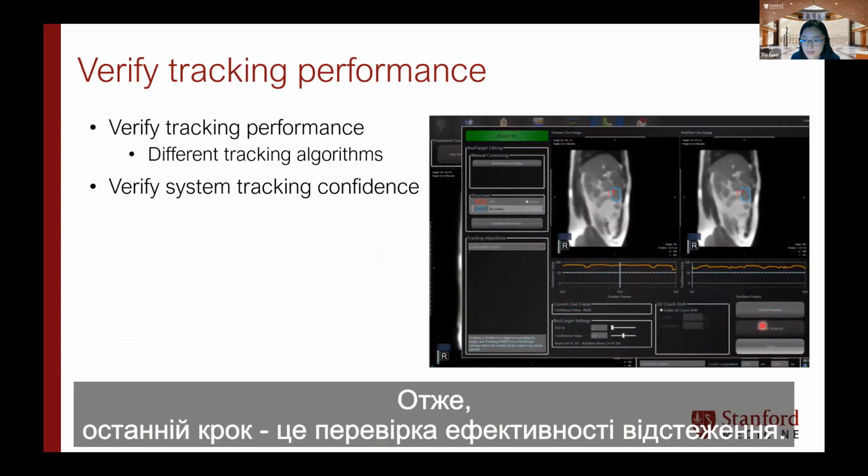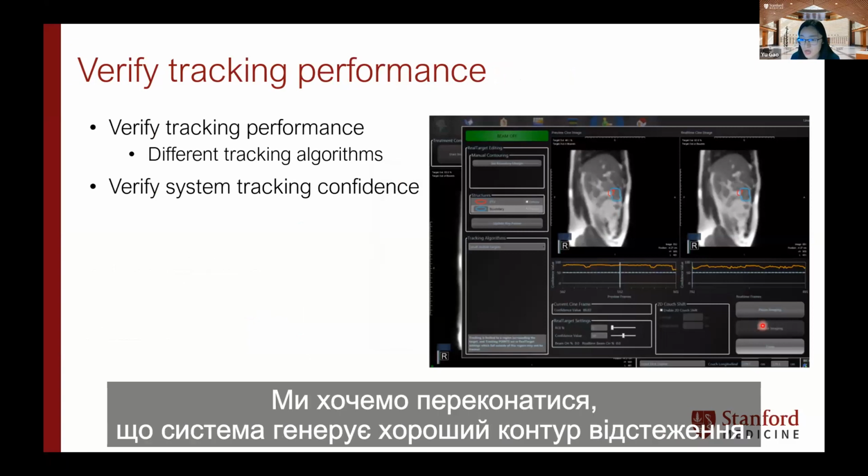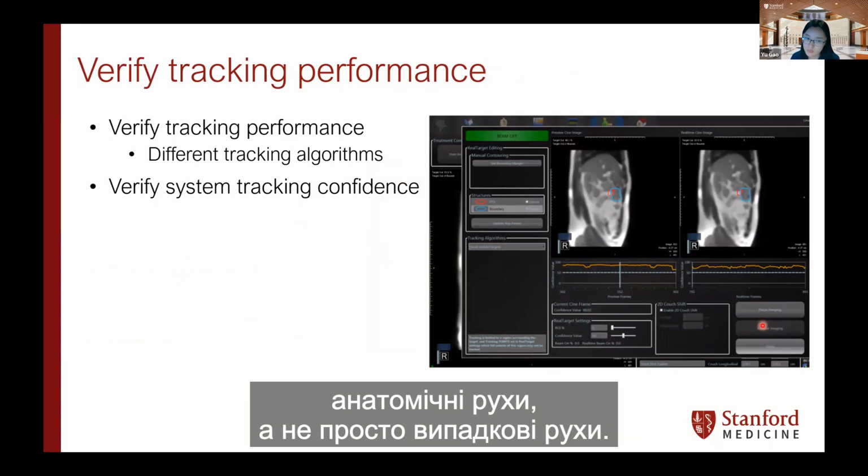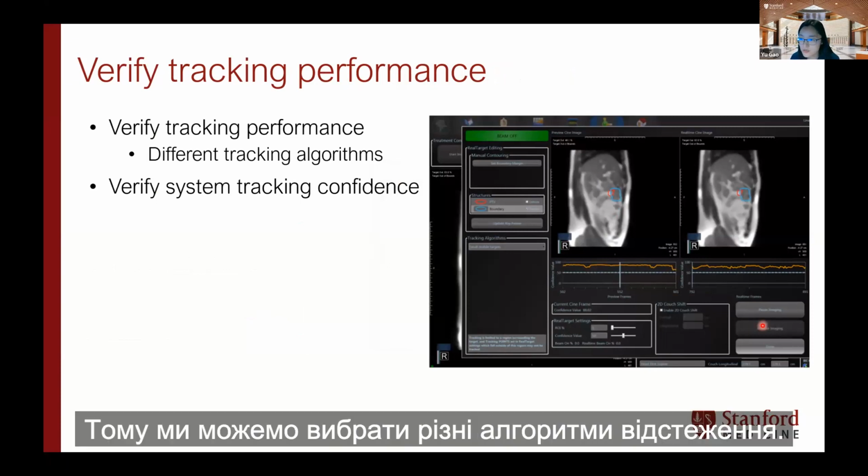So the final step is to verify the tracking performance. We want to make sure the system generates a good tracking contour. The contour should really follow the anatomy motion instead of just some random movement. There are different tracking algorithms we can select from.